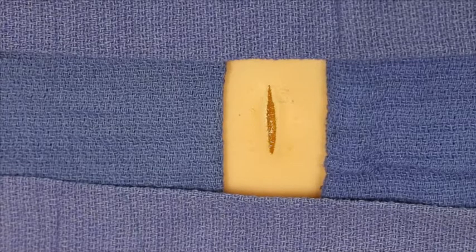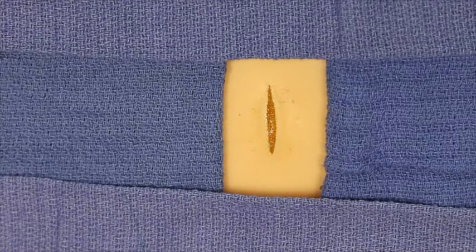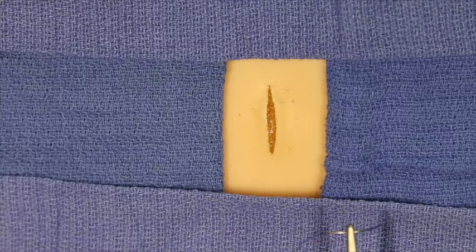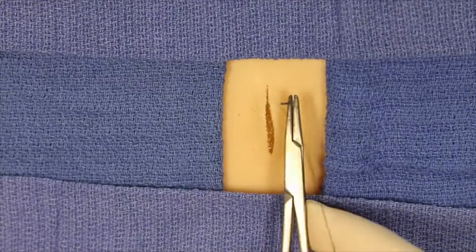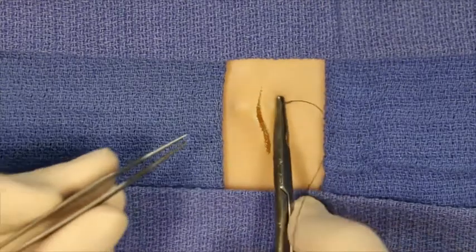The locking horizontal mattress suture is another technique that is used occasionally. The needle is inserted again at 90 degrees exiting on the contralateral side.